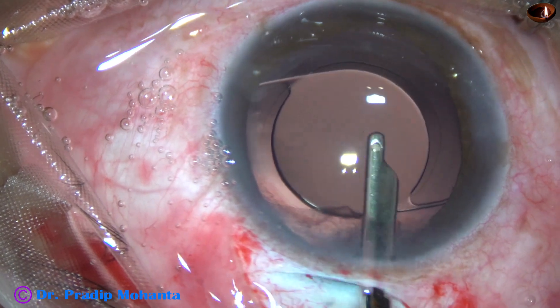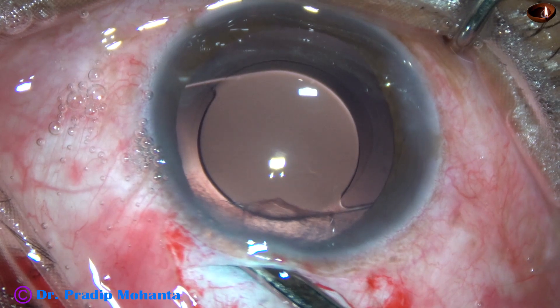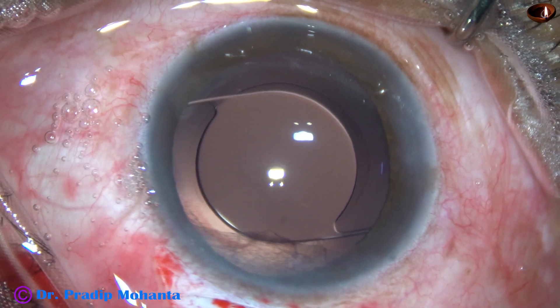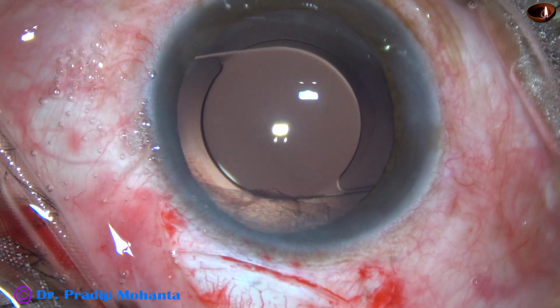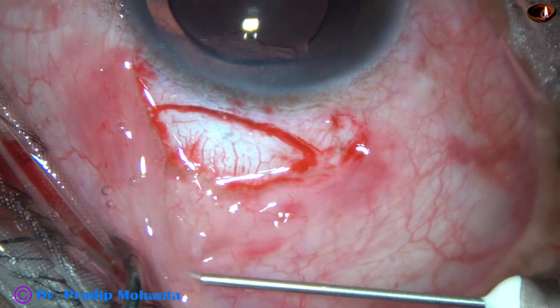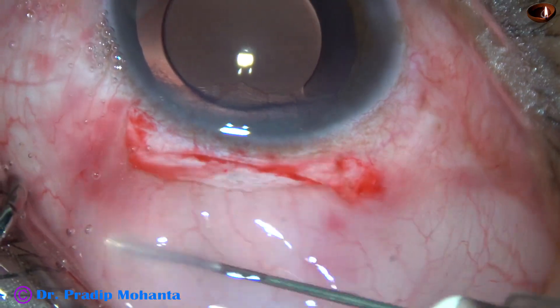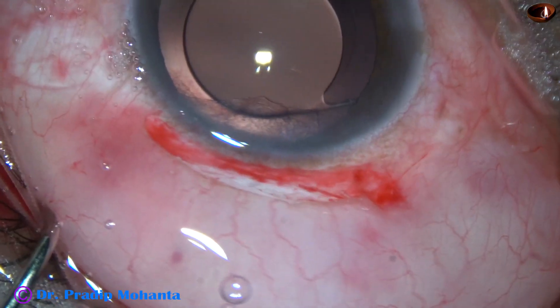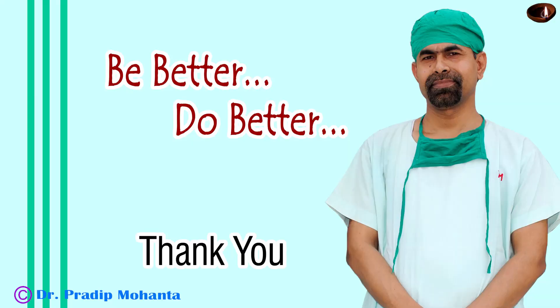This is the final lavage of the anterior chamber, which is formed very nicely. In this case, no suture was used. Gentamicin and dexamethasone are injected, and chemosis is created. The superior rectus bridal suture is removed, and as the speculum is removed, the conjunctiva gets apposed to the limbus.